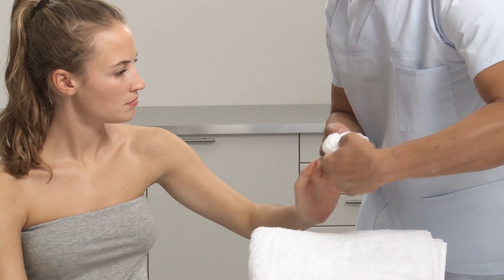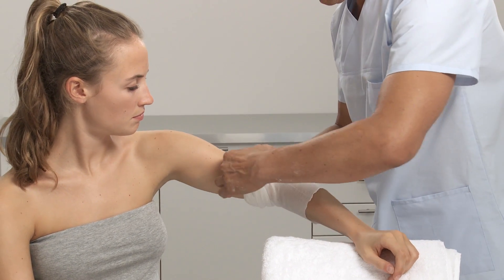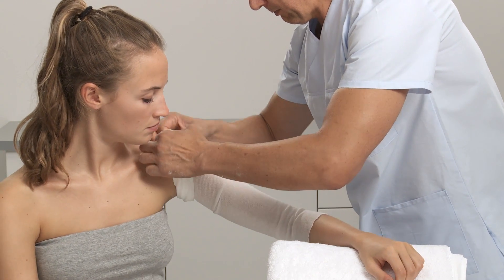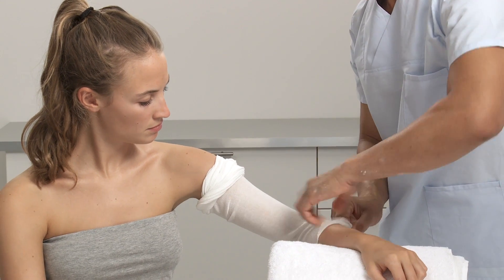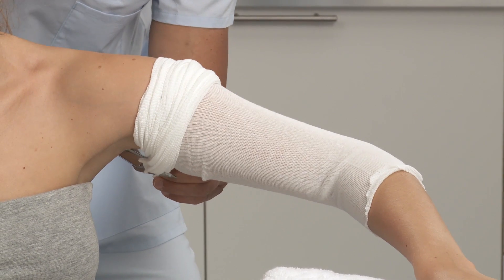Roll up the stockinette before applying onto the limb to prevent sliding pressure. Roll off over the upper arm and elbow. Make a cut into the stockinette under the armpit.